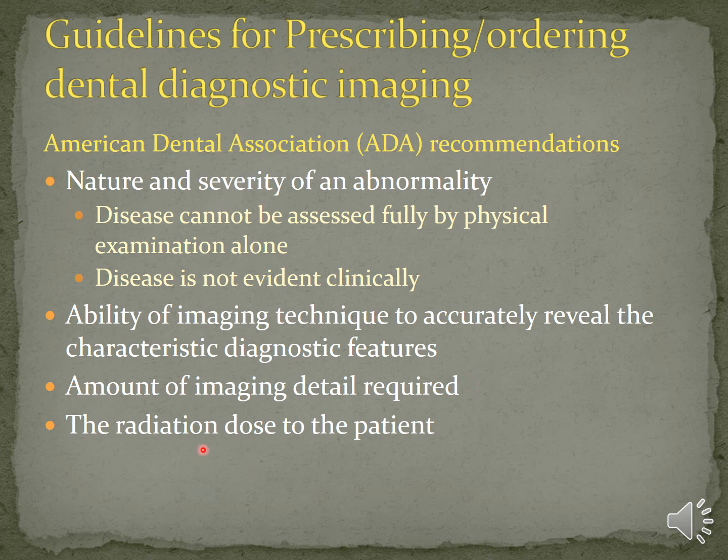Right, and it also depends on the radiation dose to the patient. For example, if you have a pregnant lady who needs an x-ray to be taken. Now, in case it's a simple filling to be done, you would probably do it without a radiograph. Or if the patient needs an x-ray and it is important to do a radiograph, then you would switch to a digital mode of imaging and try to schedule it in the second trimester, where the fetal organogenesis has already happened. So these are some very important things that need to be kept in mind before you actually prescribe a radiograph for a patient.